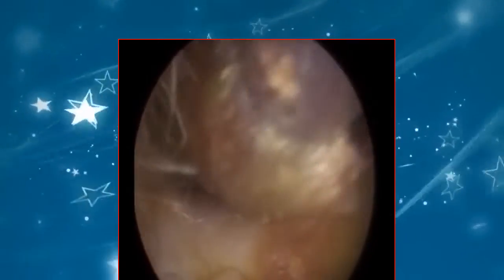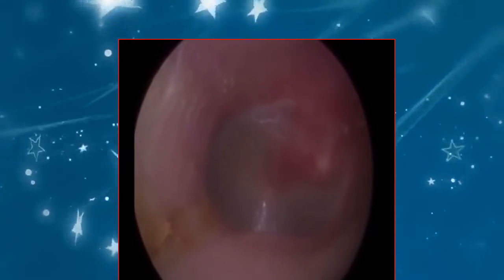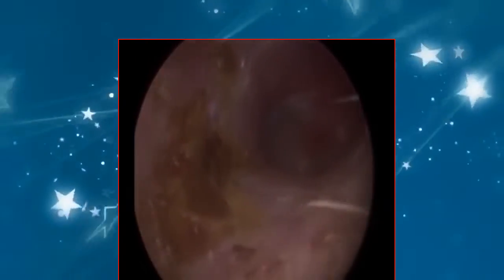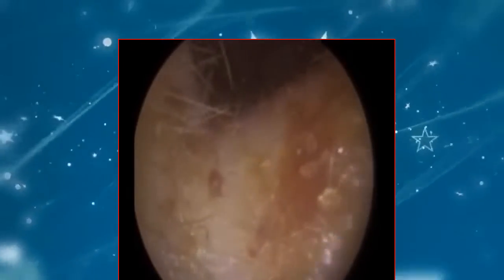See here, I've managed to get a suction grip here, fortunately, and I've removed this big boulder of wax. See, there's a bit of skin attached there, and you would have thought that was it. That's all the wax. We've cleared the ear, but there's another piece there, very medial against the eardrum, but it came out quite easily in the end. And you can see the eardrum is intact, healthy. You've got a light reflex there. And similarly to his right ear, as I extract the endoscope, you will see some dry skin coating the ear canal. If you remember, I made reference to it right at the beginning.